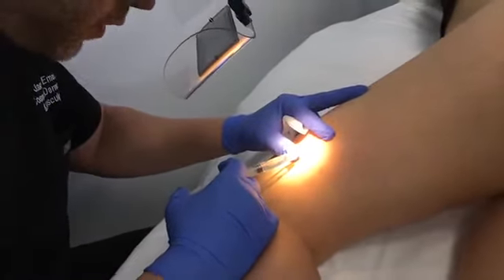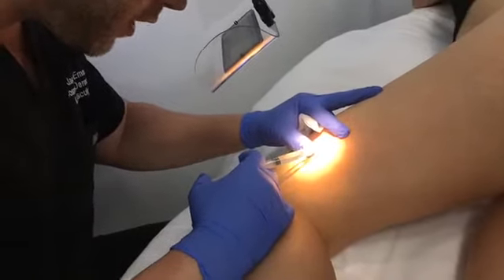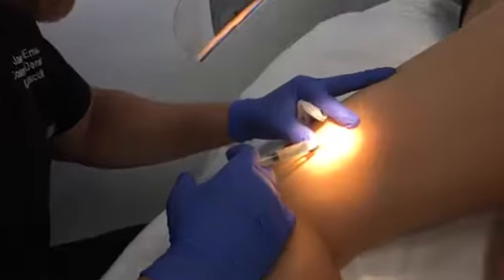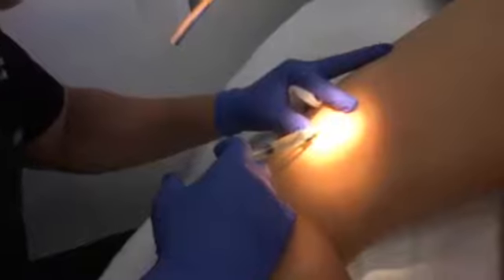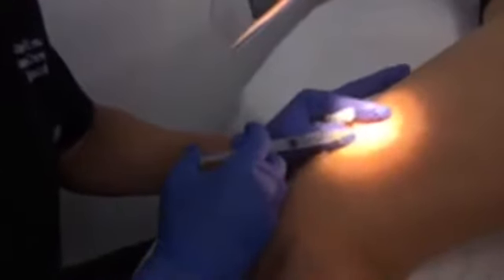I want to see that. We would do a little entrance into the vein, and then you inject it. You see how quickly it disappeared and spreads all throughout this patch. Okay, and you spread that through this patch. Look at the video. The large areas will be treated at once.